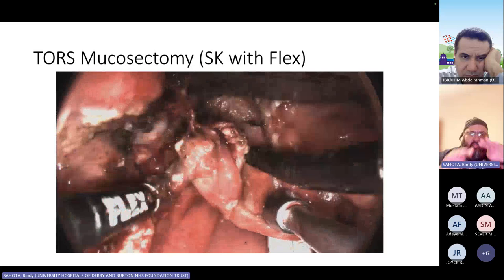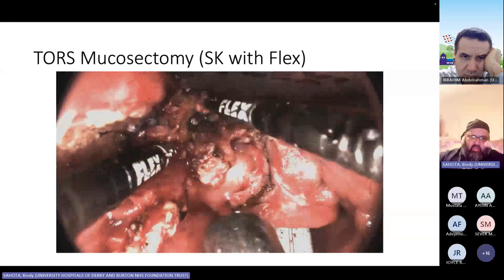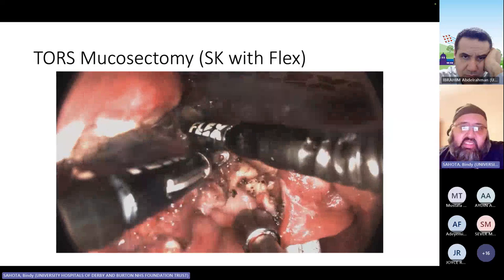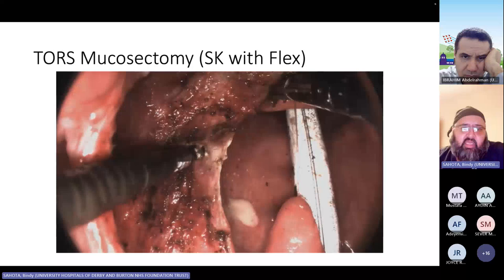So the way I kind of think about it is you make those cuts one side, you then mobilize laterally, you then roll everything down. I normally split the spine of the book, so to speak, then I roll everything down and I take that corner. The place that they're most likely going to be positive is where they're currently dissecting now. It's that corner of the tongue base going towards the back of the tongue. And so that's the place that most of these tumors actually end up hiding in.